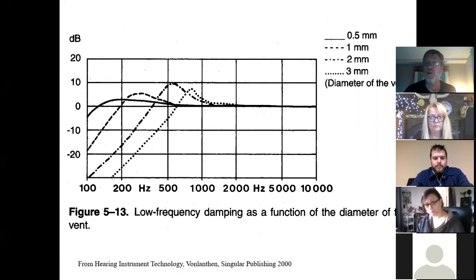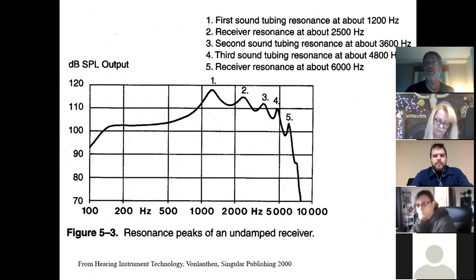And what is the range of sizes of vents? Generally from 1mm to about 4mm. This isn't even showing you a 4mm vent, but 4mm is about the biggest vent you can have.